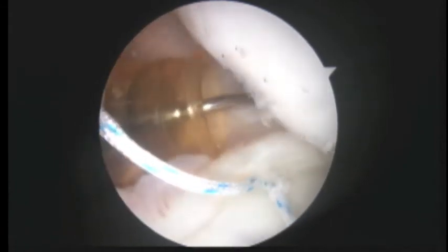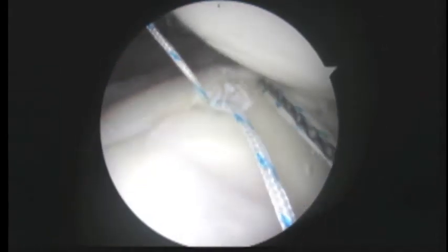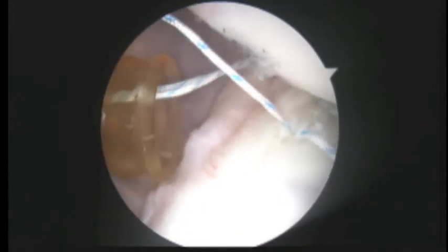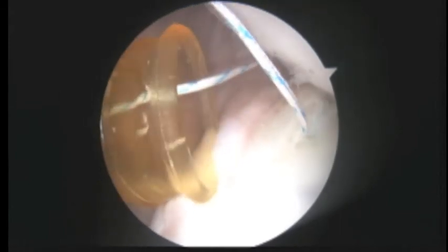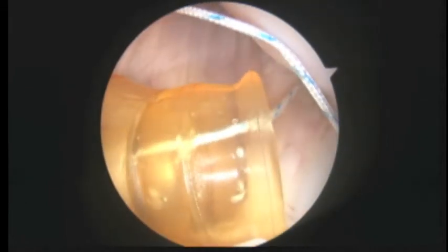So this will be our first pass. We'll get this done, show you some more in just a minute. And now as we pull back, you can see how it brings that blue and white suture with it out through the yellow cannula there. And now we're going to do a figure eight stitch, so we're going to pass that one more time.